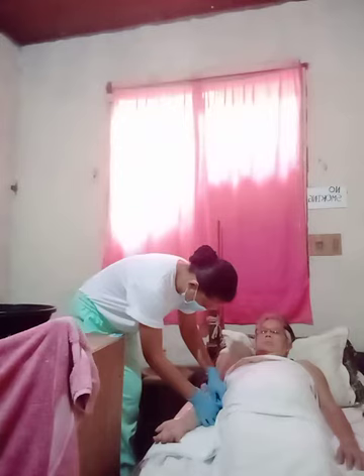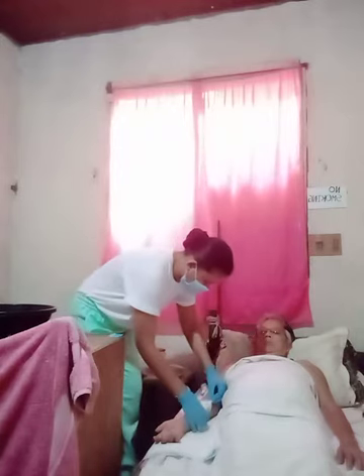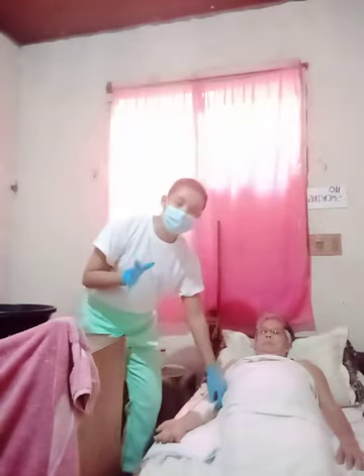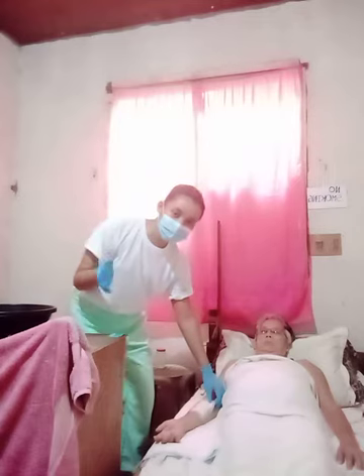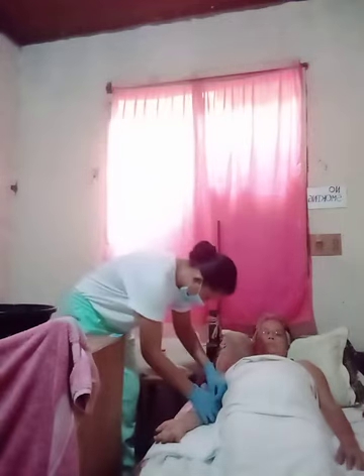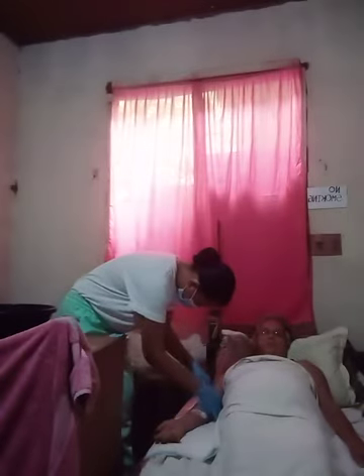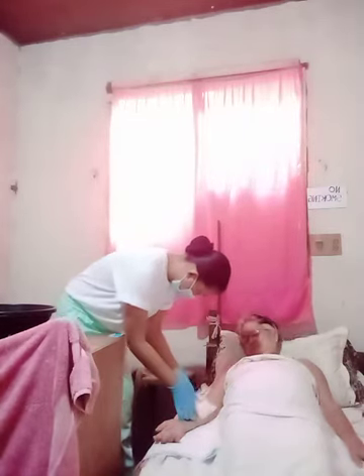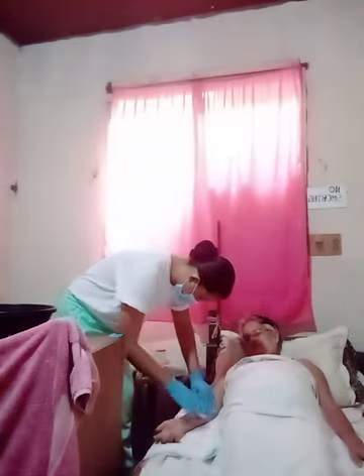If the dressing sticks on a wet-to-dry dressing, do not moisten it. Instead, gently free the dressing and alert the client of potential discomfort. So, like this.